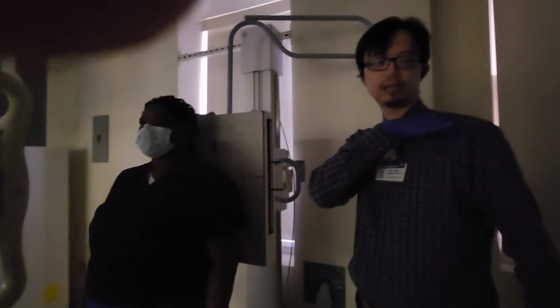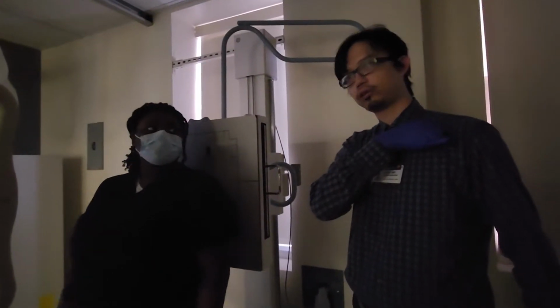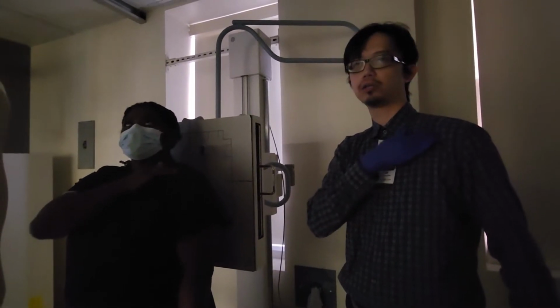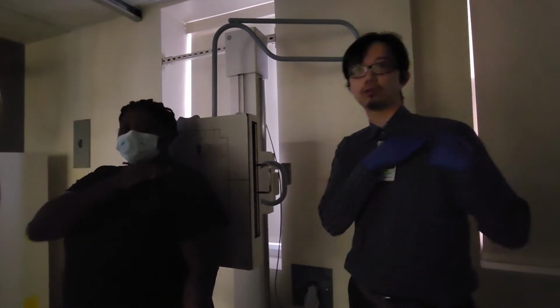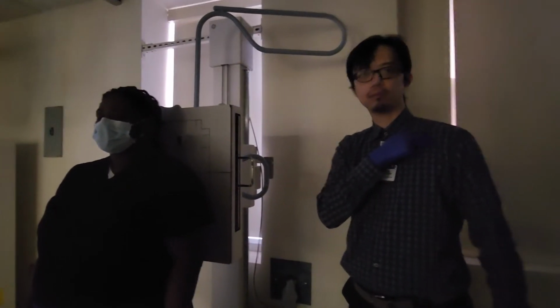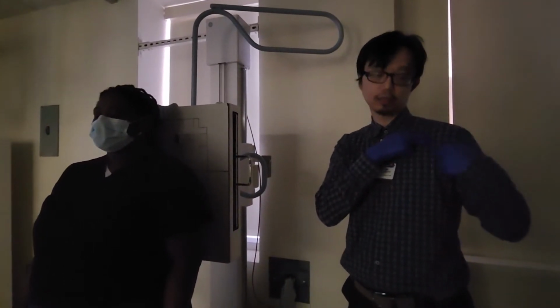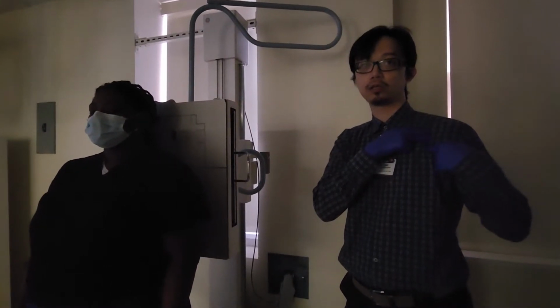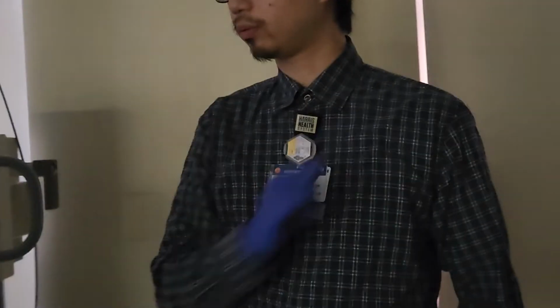So find the height of the AC, go down 1 inch, make sure you're medial to the humeral head, and that's about where the coracoid is. So even if you can't palpate it, you can make an educated guess. And then from here, once again, we go down 1 extra inch because our shoulder centering is 1 inch inferior to the coracoid. So we're centering right about here for the shoulder.